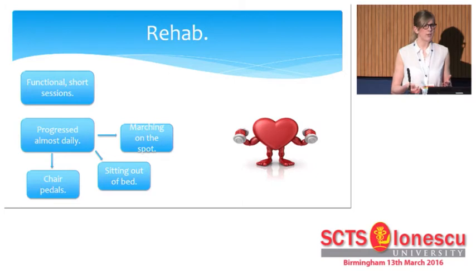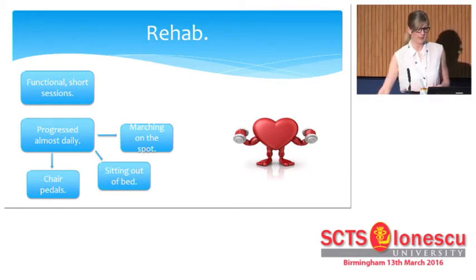And he managed really, really well. We had no problems with the ECMO, he was stable throughout, and he was really pleased to be able to get up and start moving. And we were able to progress his rehab almost daily, and he built up to being able to march on the spot, sit out of bed for longer periods, and he was using our Motormed chair pedals regularly.